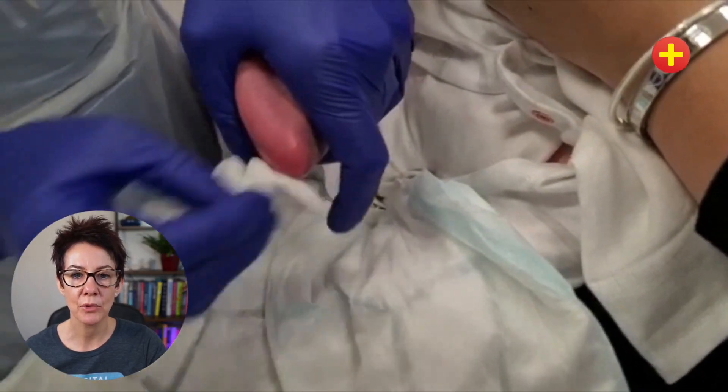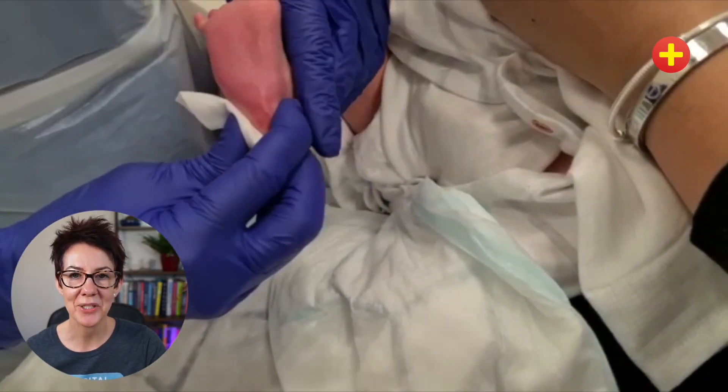At the end of the procedure, just press some gauze to the baby's foot and make sure they have time for a nice cuddle.